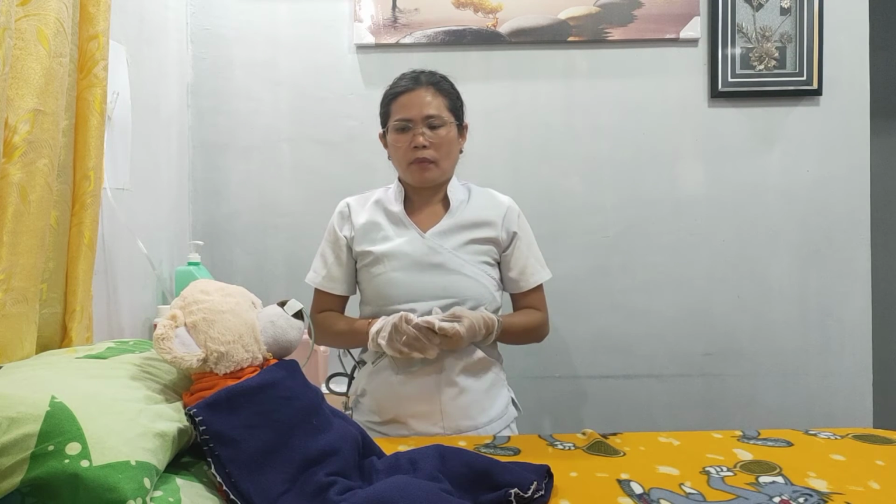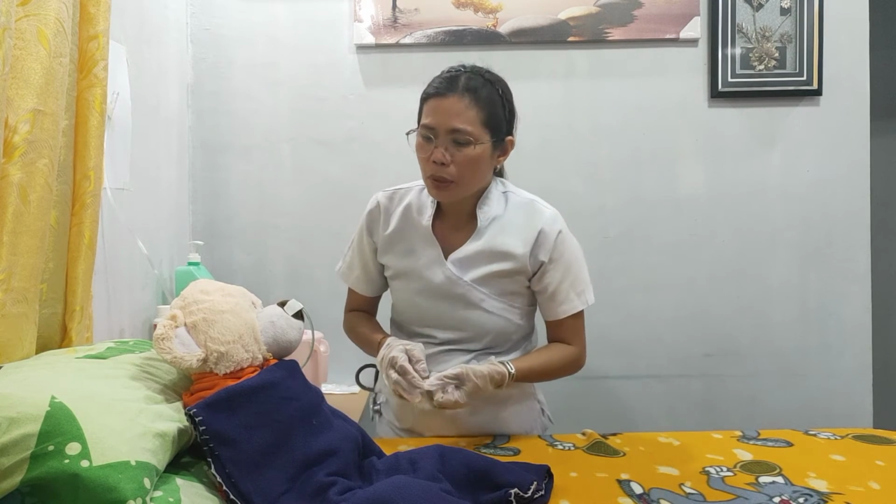Ask the patient to open their mouth and check the back of the throat, because this is to ensure that the tube is not coiled. Ma'am, can you open your mouth? Ensure that the recommended external length of the feeding tube is measured and consistent during the feed. The feeding tube should be secured firmly to the nose, cheeks, and chest with a clip.